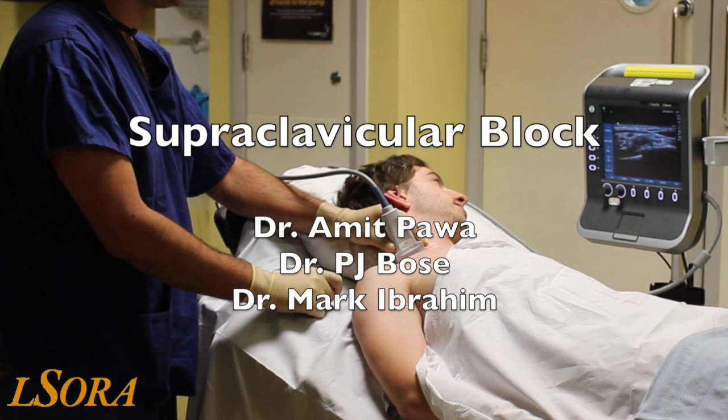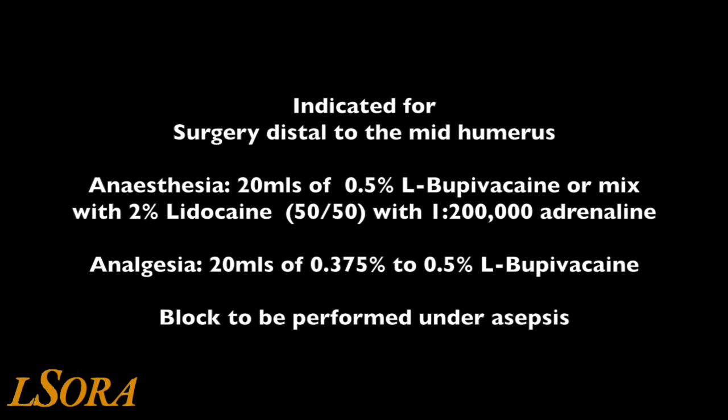In this video, we will show you how to scan and the sonoanatomy required to perform a supraclavicular brachial plexus block. This is an excellent block for surgery distal to the mid-humerus, and some even call it the spinal of the arm for the dense analgesia and anesthesia provided.